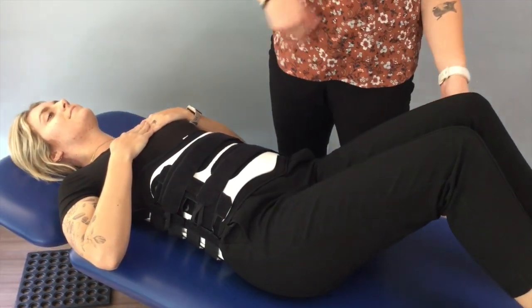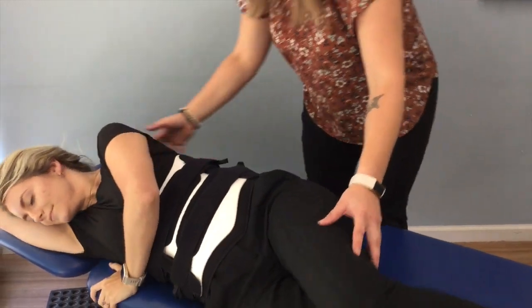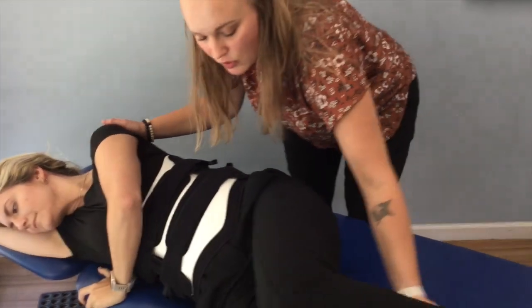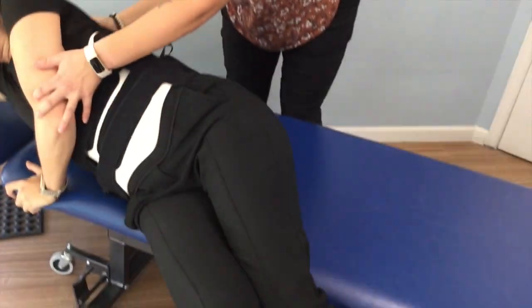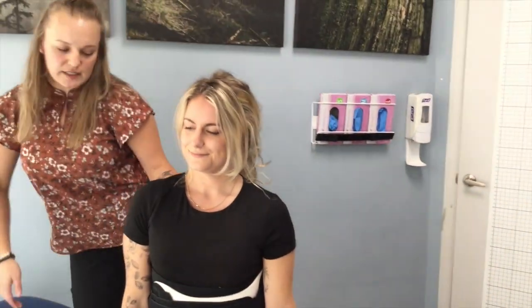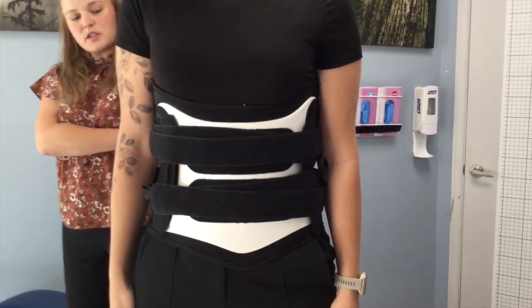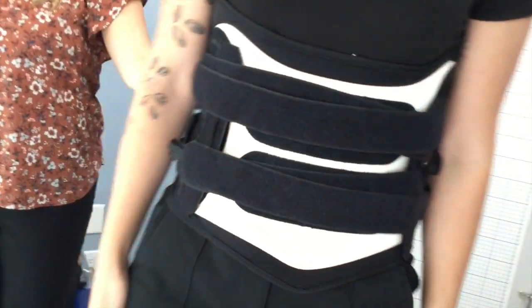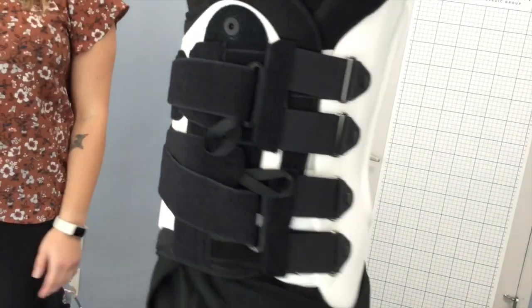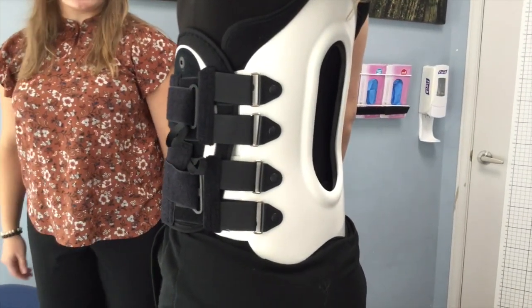We're going to ask the patient to log roll towards the camera and get up from the table. We need to drop our knees and push with our hand to be in a seated position. She is now wearing the brace — go ahead and stand. We'd like the camera to see the strapping mechanisms from the side, so we're going to spin to the side and raise an arm so you can understand what that looks like on the body.